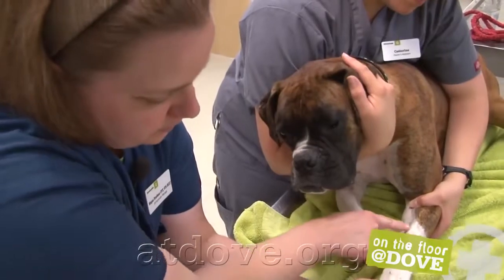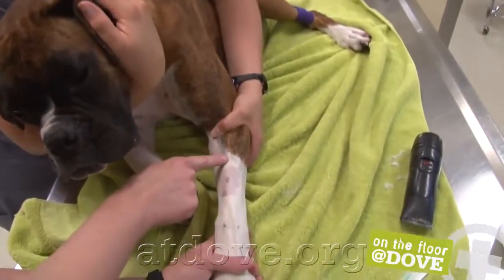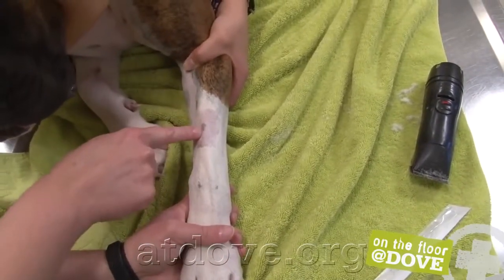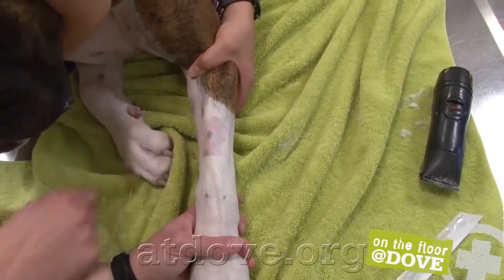So these two, the accessory branch and main cephalic, come together right here. So this vein runs right over the top of her leg. You can see me kind of pushing it out of the way. That's where I'm going to go, right in there.